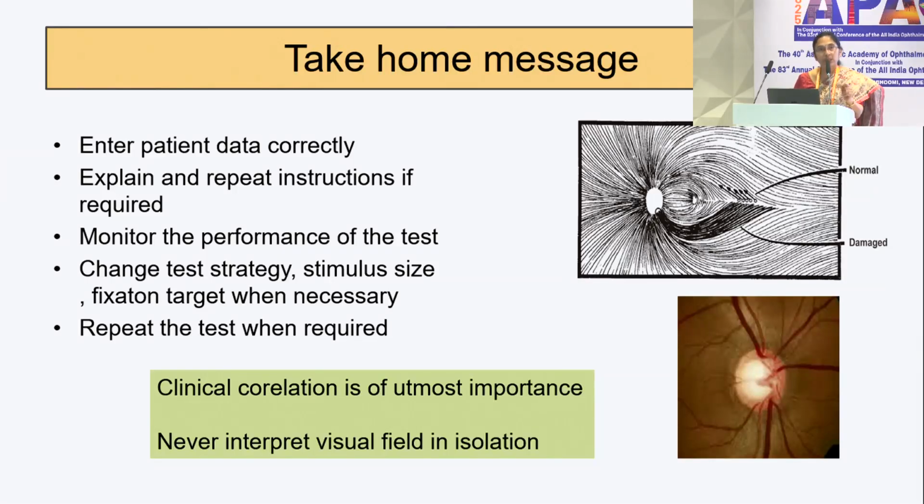So clinical correlation is very important, and never interpret visual fields in isolation.